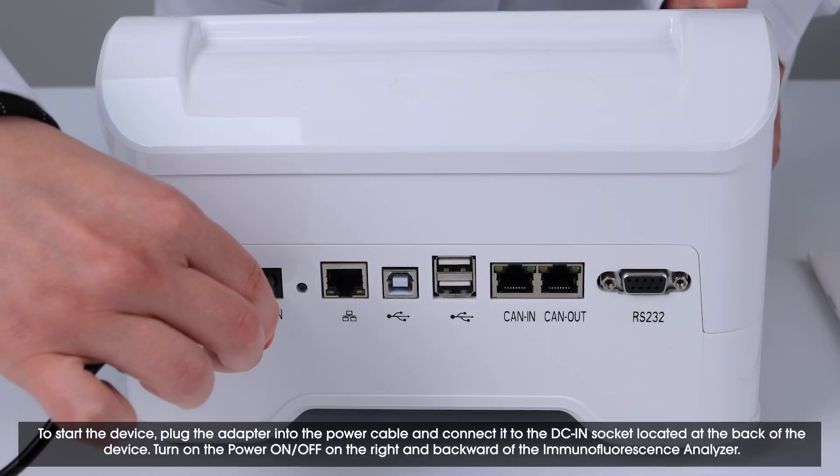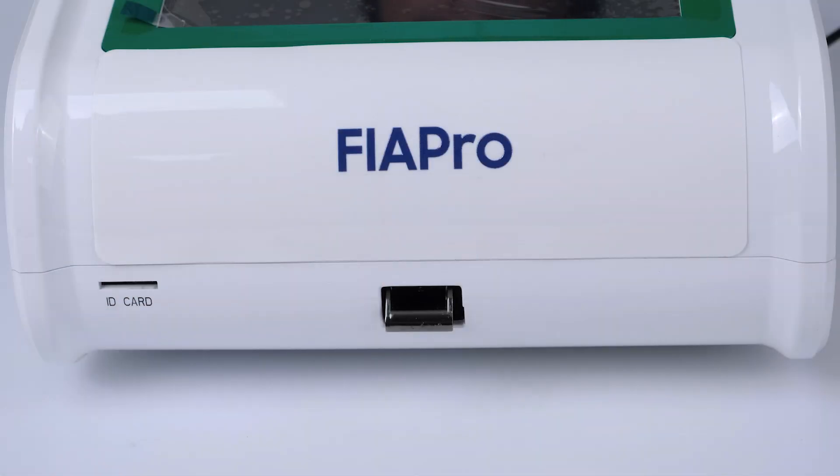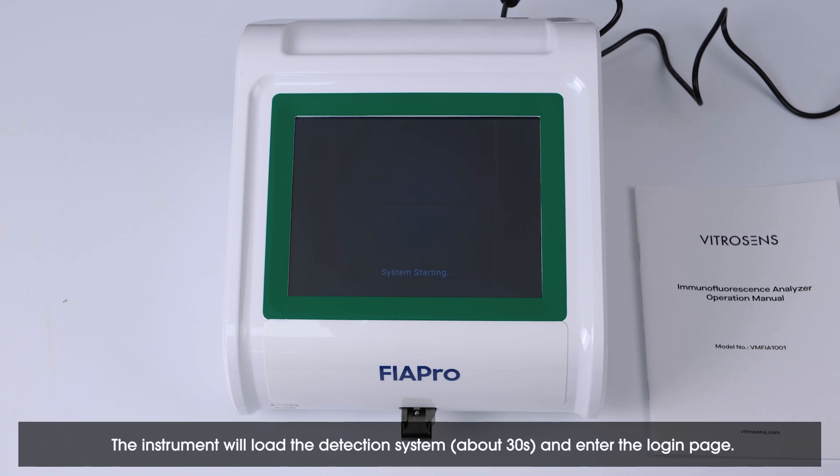To start the device, plug the adapter into the DC IN socket and press the ON/OFF button. The instrument will load the detection system in about 30 seconds and enter the login page.